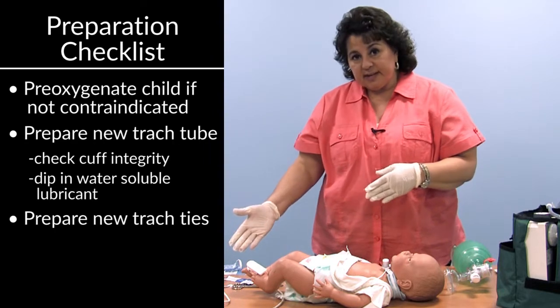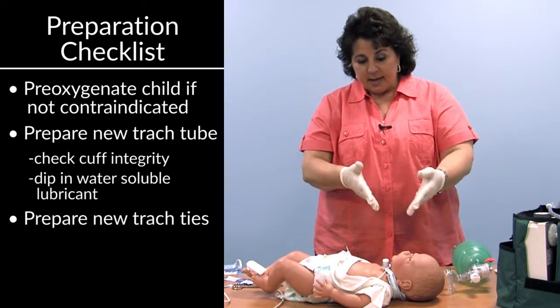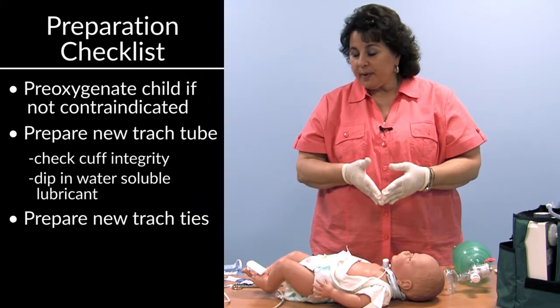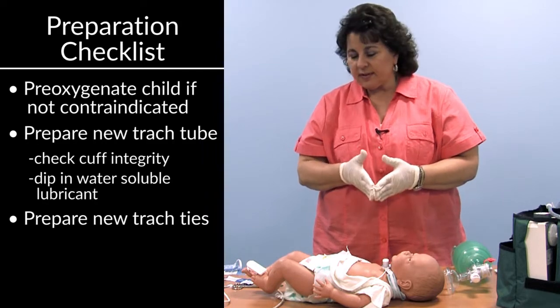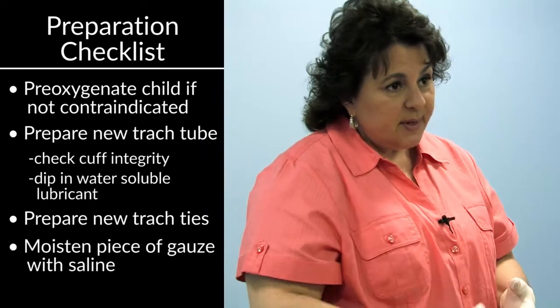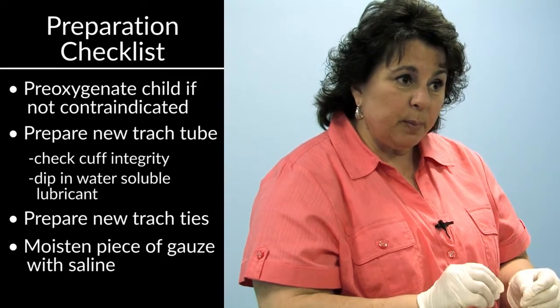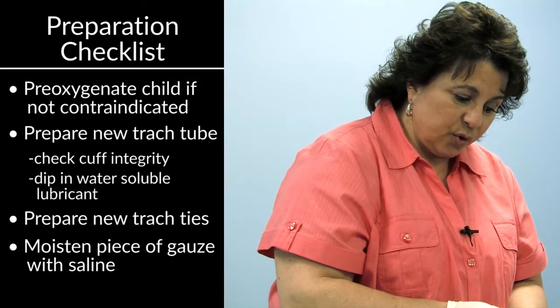We have our trach ties here available, the new ones to put onto the neck after we've inserted the tube. And I'll show you the way I like to do it. Totally up to you, what your preference is. We have a moist piece of gauze so that we can wipe the neck while we're observing for that moment between the old tube coming out and the new tube being inserted.